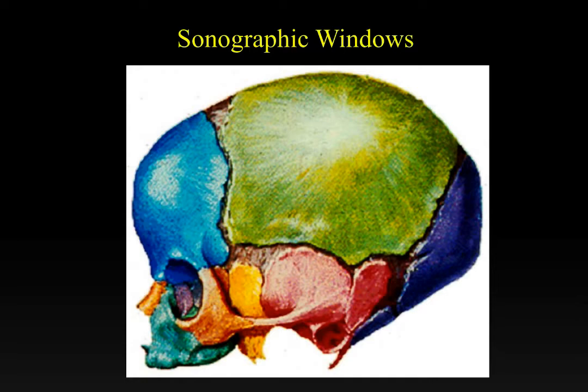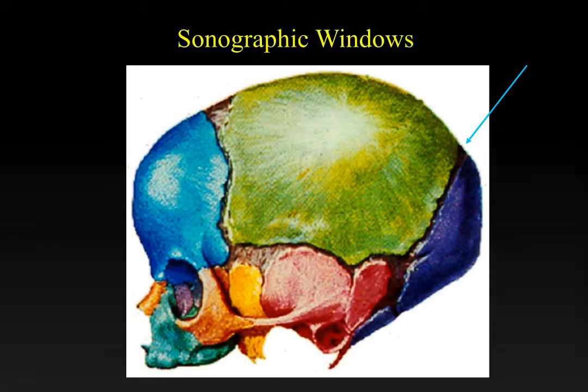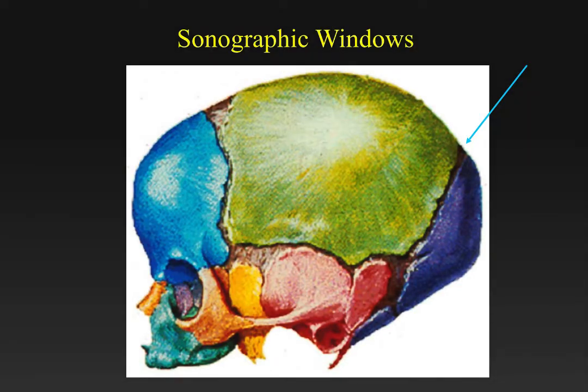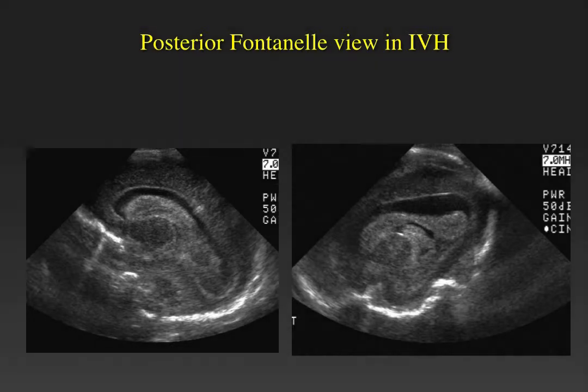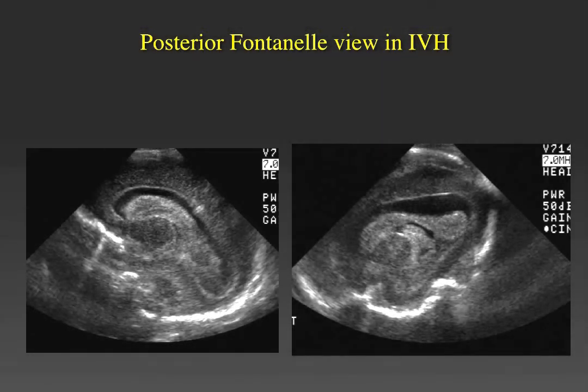The first fontanelle I'd like to cover is the posterior fontanelle. It's located at the junction of the parietal and occipital bones, in the midline, and can be found by simply bringing the transducer posteriorly along the midline until you feel the opening of the posterior fontanelle. You can typically image in both sagittal and transverse orientation.